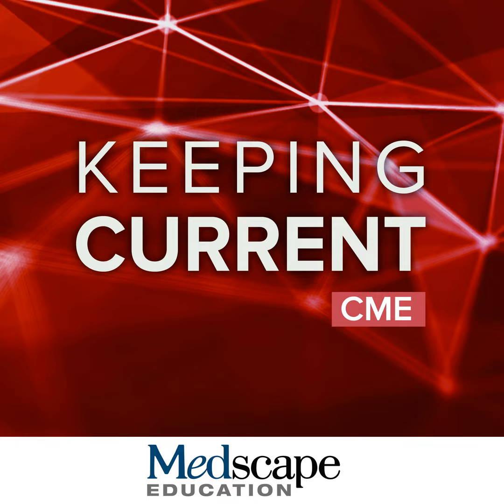brain MRI. And that would be to exclude other causes. And this is an example of a patient with normal pressure hydrocephalus. So the ventricles are too big. So that's another cause of dementia. What we now have to have in the back of our minds is that this MRI visit should also be able to address eligibility for therapies if they are determined to have Alzheimer's disease.